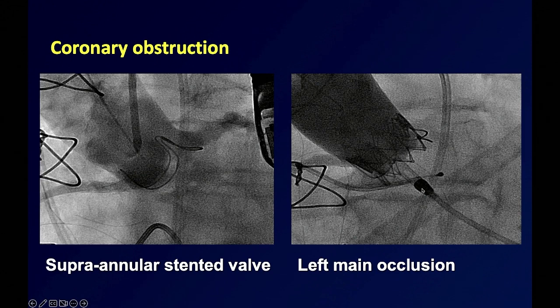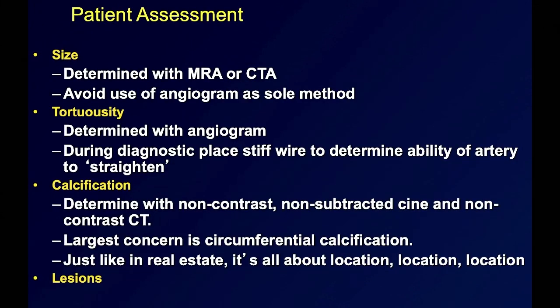The first thing that went in is actually an impeller, because otherwise the patient is going to have VFib arrest and die. Actually, this patient had a VFib arrest. So then you can take your time to open that coronary artery. And how about the assessment of the patients?